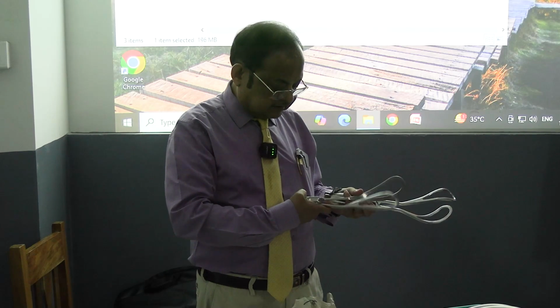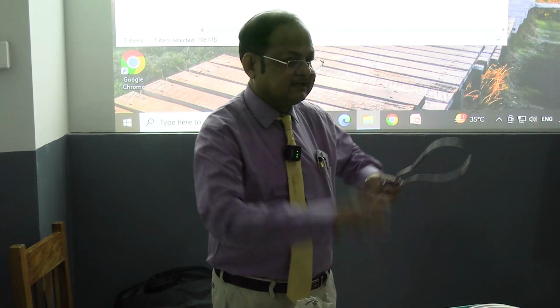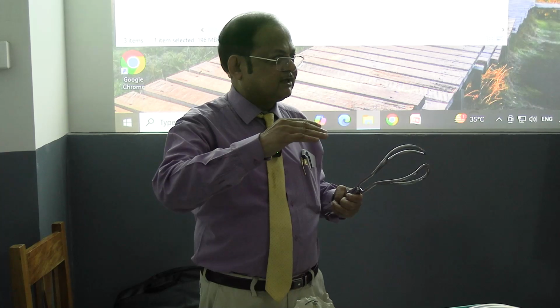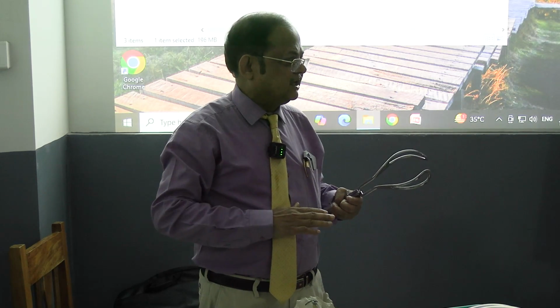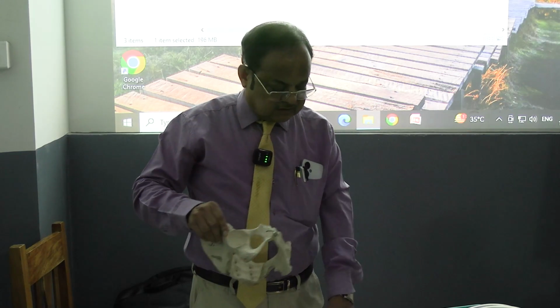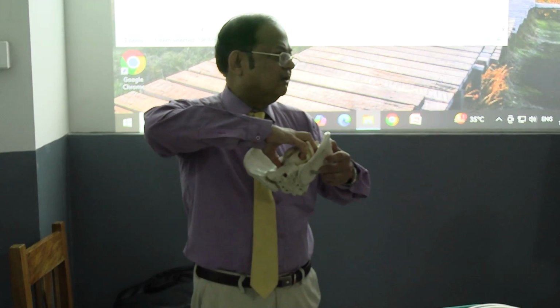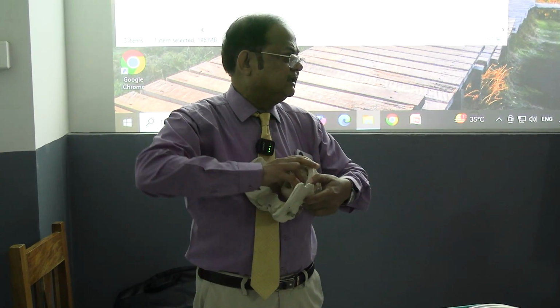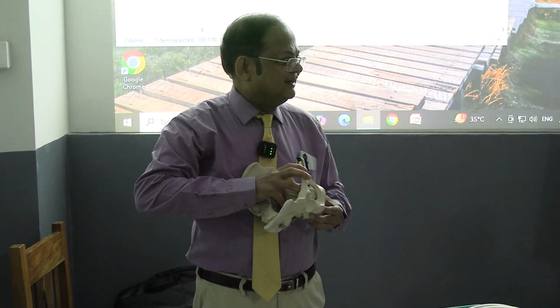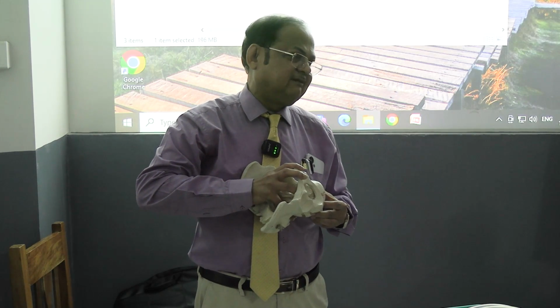There are three types of forceps operation. That is the classification. One is the outlet forceps operation, one is the low forceps operation, and one is the mid forceps operation. High forceps operation is not used. Understand? Outlet forceps means the head is very low down, that is, the head is on the perineum, and the fetal head is visible in the vulva between contractions.